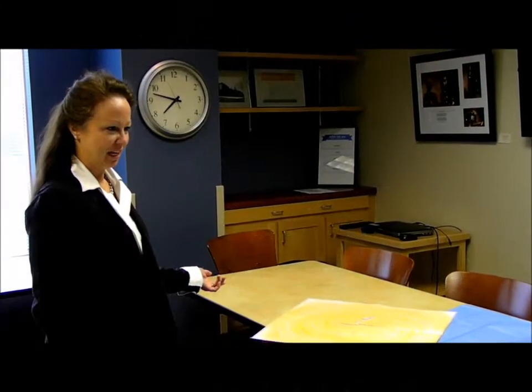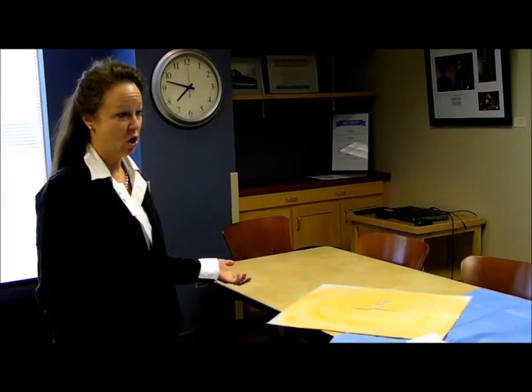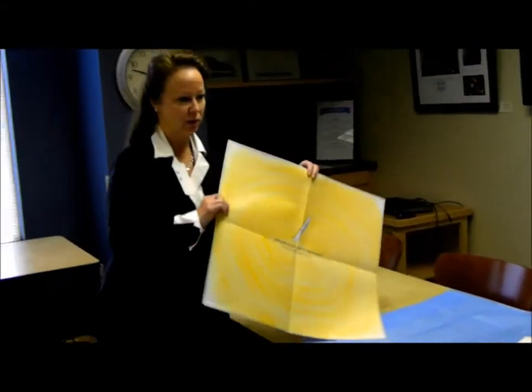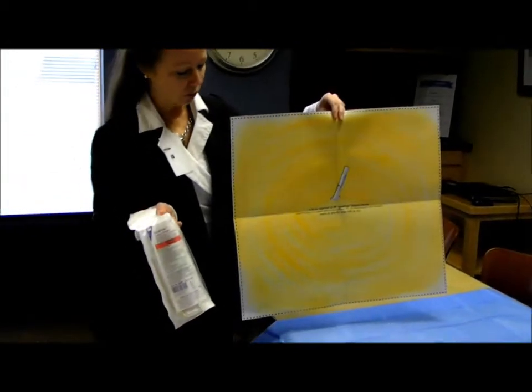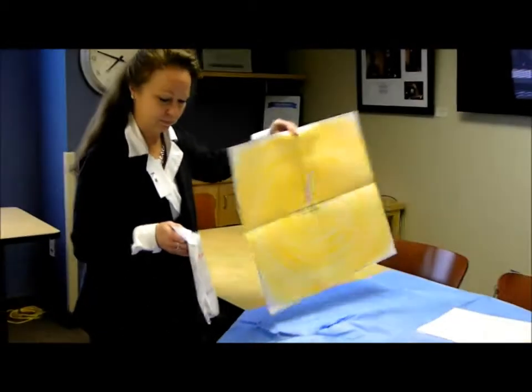DuraPrep today. DuraPrep is a prep solution. It is composed of alcohol and iodine povacrylex. It covers an area of about this large with a 26 mL applicator. That is the larger applicator. We also have a smaller one, but this is the one that you would see used in OB that you're probably familiar with.